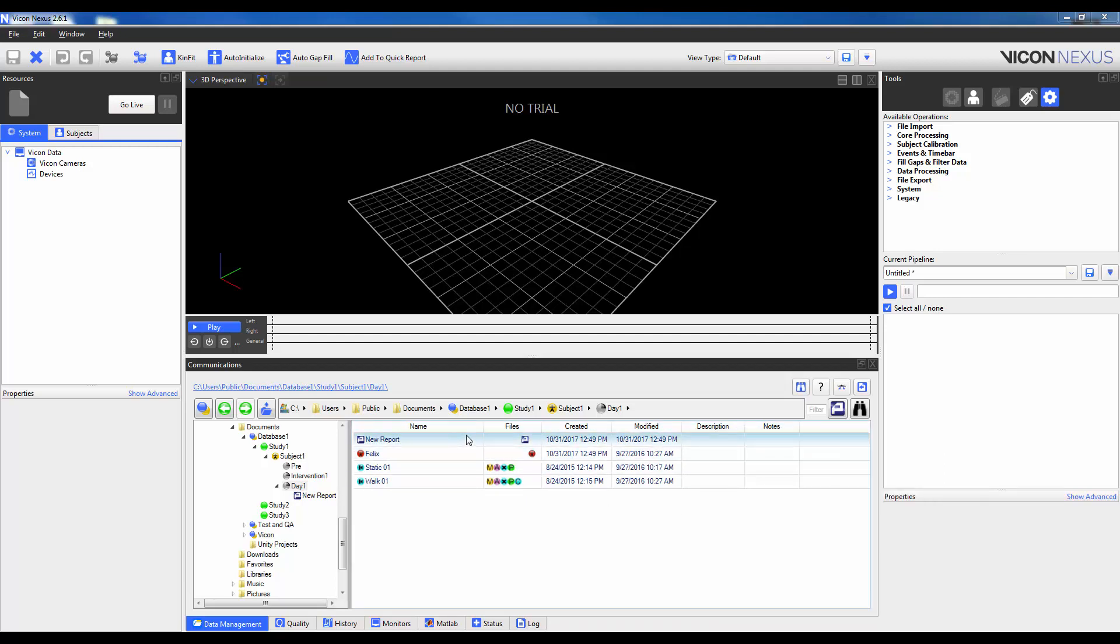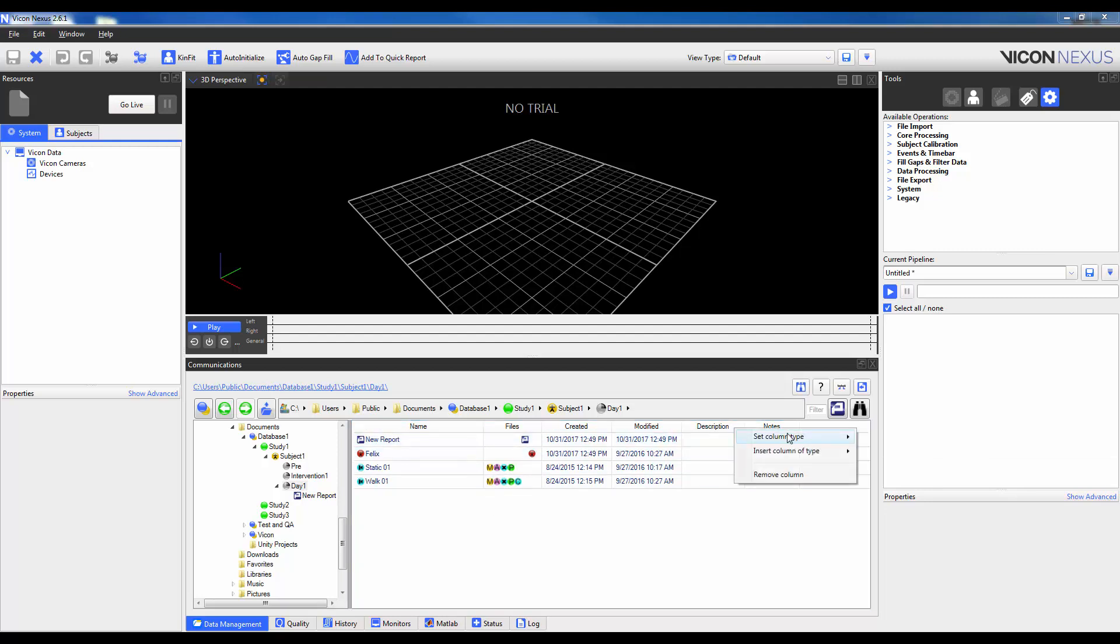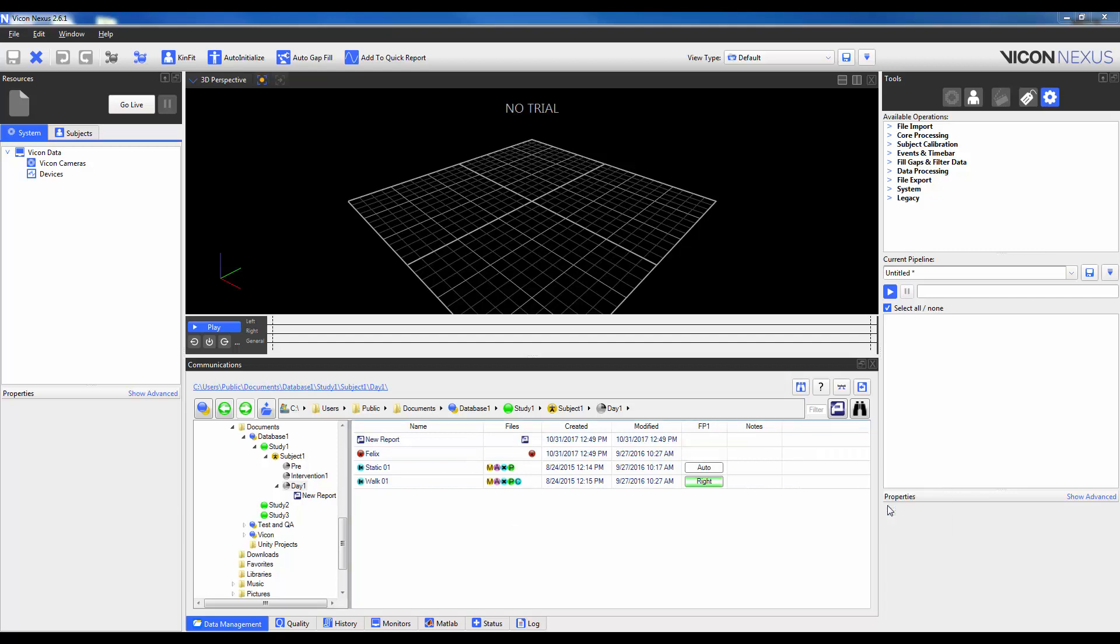Remember, I cannot remove name or files, but I can insert a Column in between the two if I would like. So if I want to change the description to, let's say, a Force Plate, I can right-click and do that here. Now you can see here that I have the ability to assign a foot contact to a Force Plate.